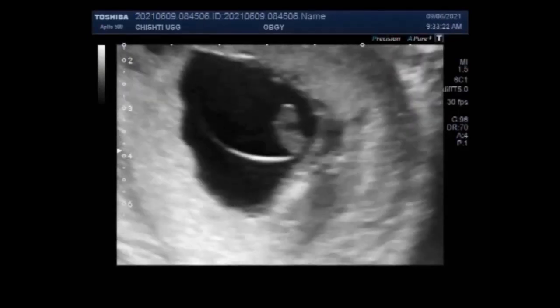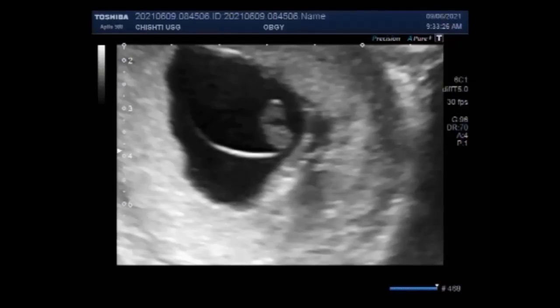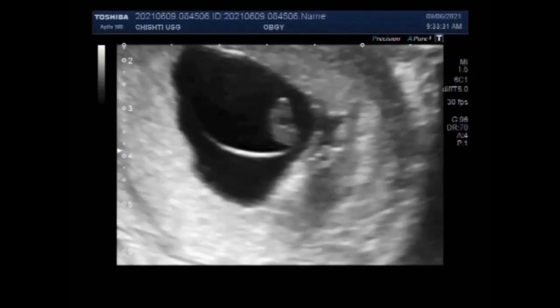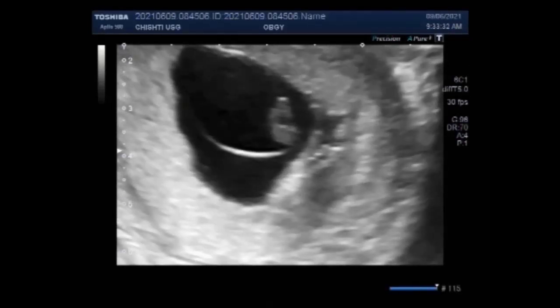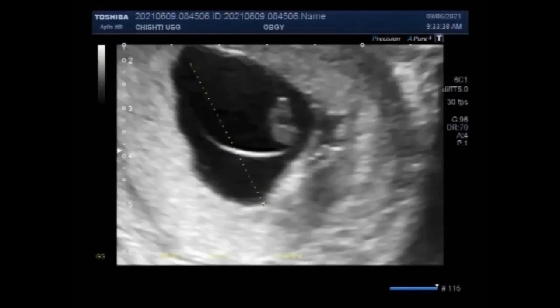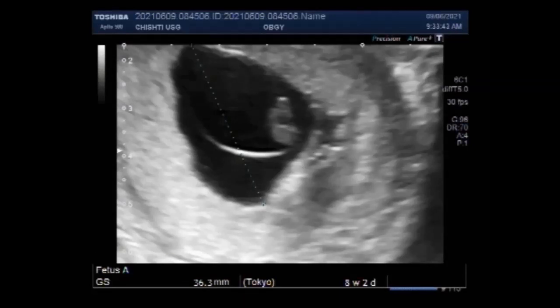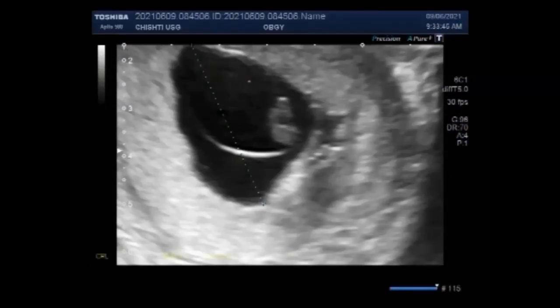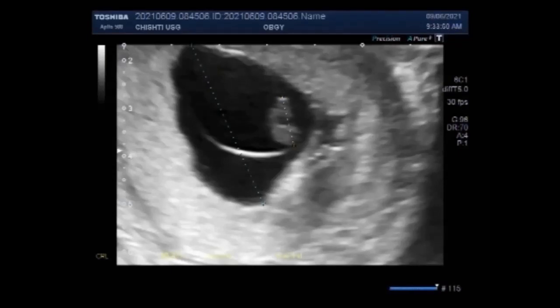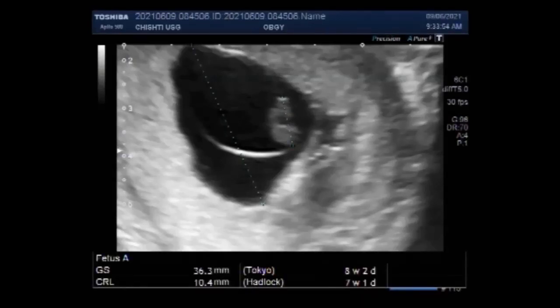Missed abortion means that your baby has stopped growing. As in this case, the gestational sac shows a fetus with fetal demise — the fetus has stopped growing. There is fetal demise but no miscarriage symptoms such as bleeding or pain. It can also be called delayed miscarriage. Some experts refer to this type of pregnancy loss as a missed miscarriage, and the loss may go unnoticed for many weeks.